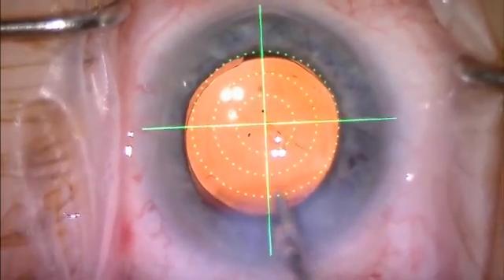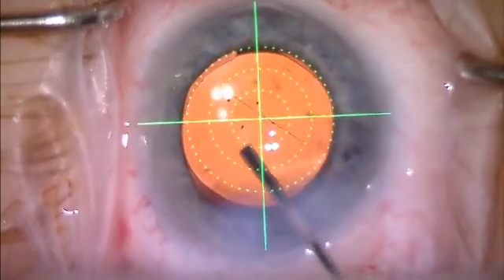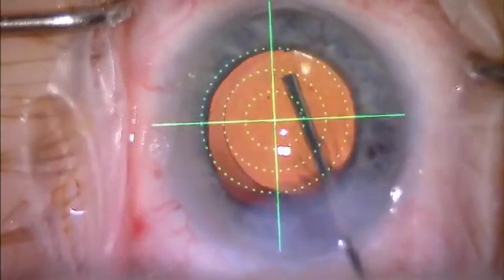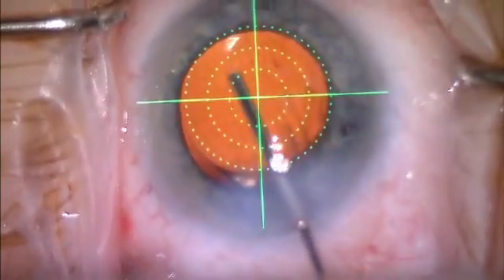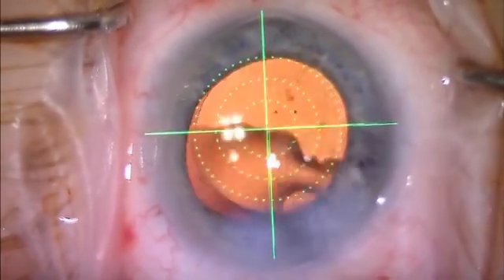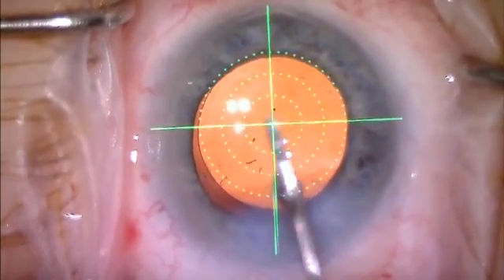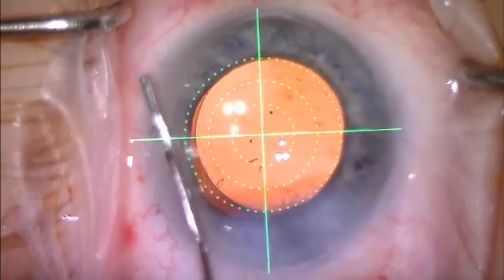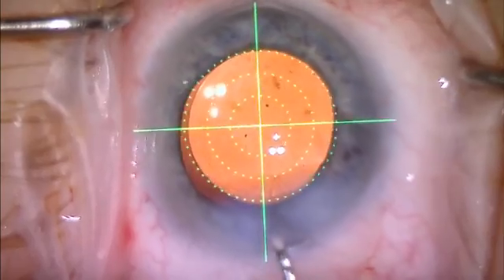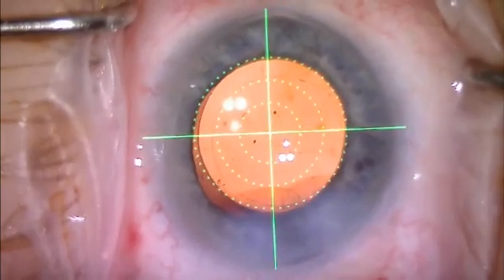So what we've done now is we've moved it a little bit inferior, but it's still temporal. And at this point, our foot plates are almost at 3 and 9 again. So I'm going to continue to rotate that and see if we can't get it to center a little bit better. And now you can see it is centered almost perfectly on the axis. So here the foot plates have ended up at 3 and 9 as opposed to 12 and 6, which we've done traditionally. To me, that's the real advantage of the VERION system.